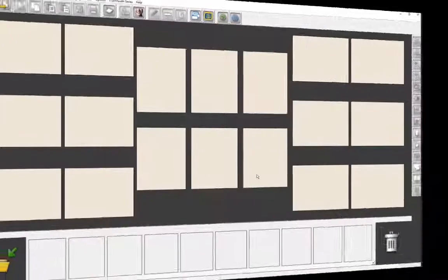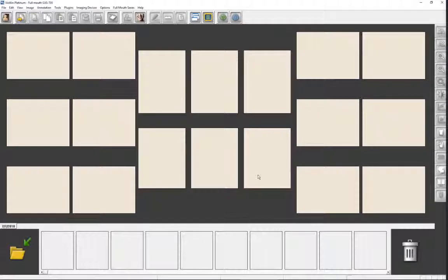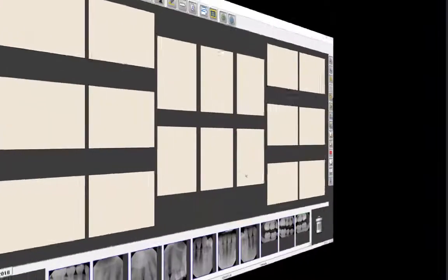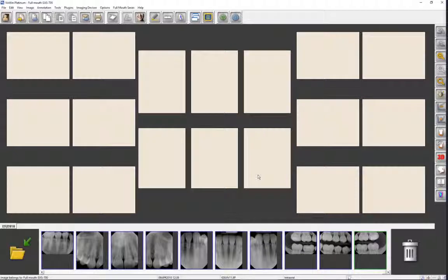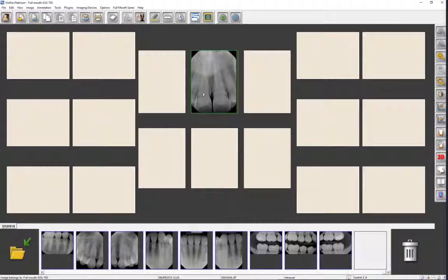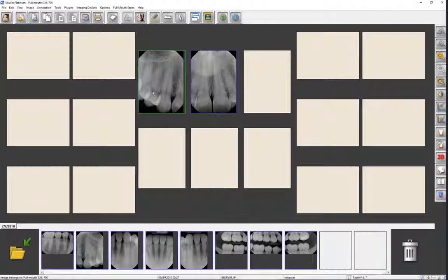When we return to the mount, the numbers are removed and there is no green highlight. Let's reopen the patient record after X-rays have been taken. Because we deselected Direct Capture Scan Into the Mount, our X-ray images were saved in the image bin instead. To move the saved images to the mount, left mouse click on an image and drag it into the mount.